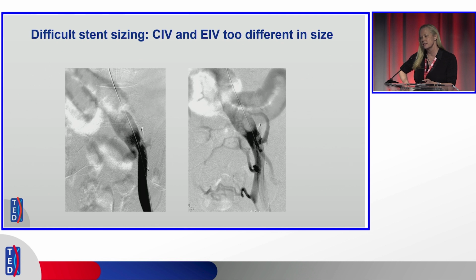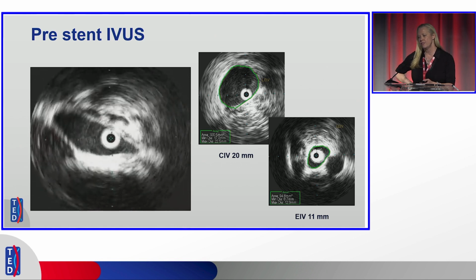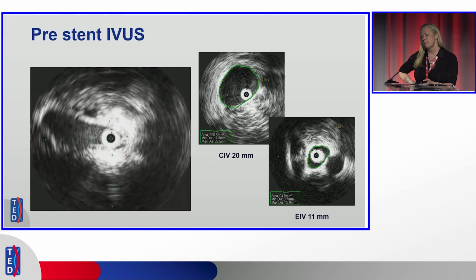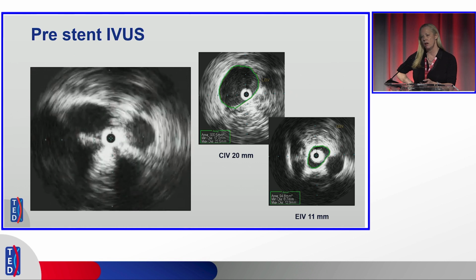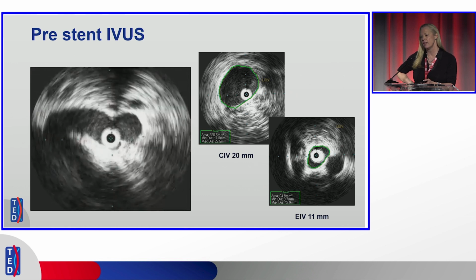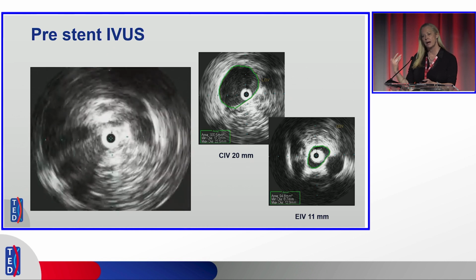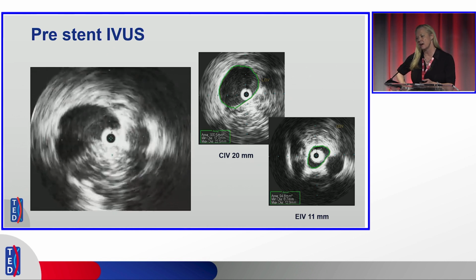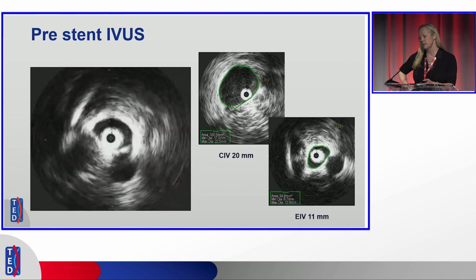And here's another difficult sizing situation when there's a massive dilation of the common iliac vein, yet the external iliac vein is really small. This is a man who had gonadal vein embolization for persistent pelvic floor and scrotal pain. He has a pretty significant iliac vein compression, we'll see here in a second, but the pre-stenotic dilation of his common iliac is huge by comparison to how small his external iliac vein is, and this can be a really challenging situation. Now, sometimes when the vessel's really large like this, you may be measuring obliquely and you might overestimate the vein size a little bit at the top, but certainly in this patient, the external iliac vein is significantly smaller than the common iliac vein.